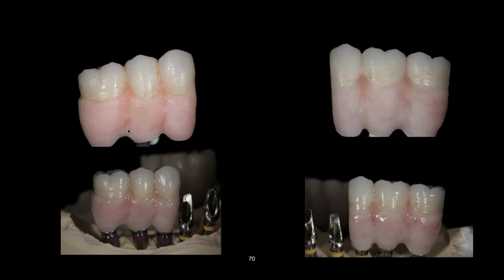This is the G4 mixed with GC clear with the window material, at least 50-50. Then once it's baked, I smooth it out and I paint it with the stains, the accent stains. This is the pure G4, and then most of this is clear. Now you have this zirconia underneath here that's more bony, and so this is why you get this look.